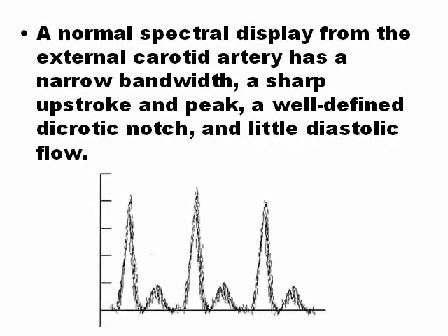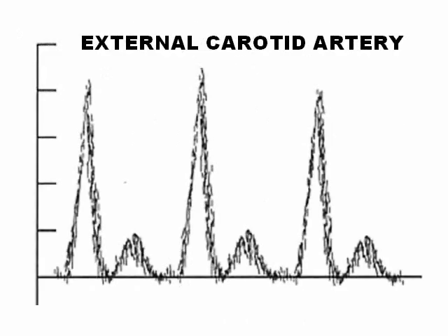Here we are going to study a normal display of the external carotid artery. This is called high resistance flow. External carotid artery is peaky and also has other very important characteristics. The flow in the diastole, in other words the end diastolic flow, is very low, sometimes near zero.